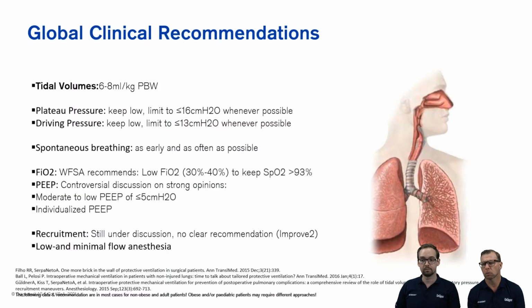What are the global clinical recommendations? Now, this comes from the anaesthesia societies, both in Europe and the US, and across Australia and New Zealand and the region. There's a lot of data and information out there to support these recommendations. These are most certainly not Dräger's recommendations. These come from the global societies that support lung protective ventilation in the OR.